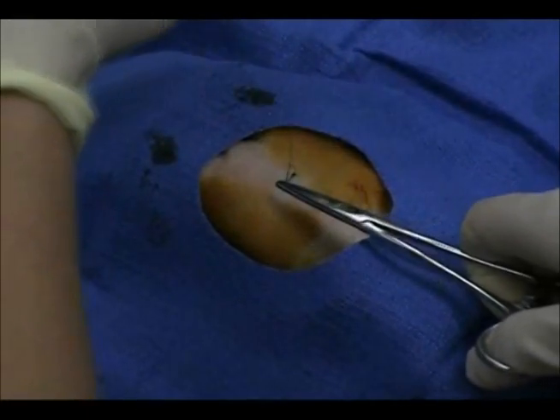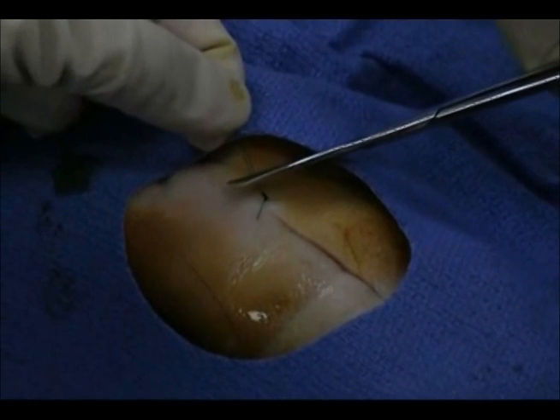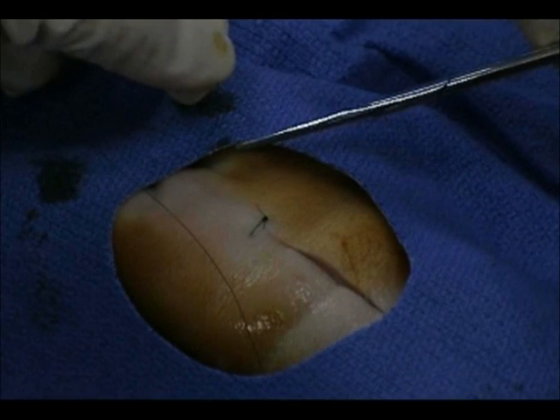When the knots are completed, lift up both suture tails and cut them to a 5-8mm length so that they do not hinder the next suture. Pull the tails off to the side of the wound so that the knot does not become part of the scab during wound healing.